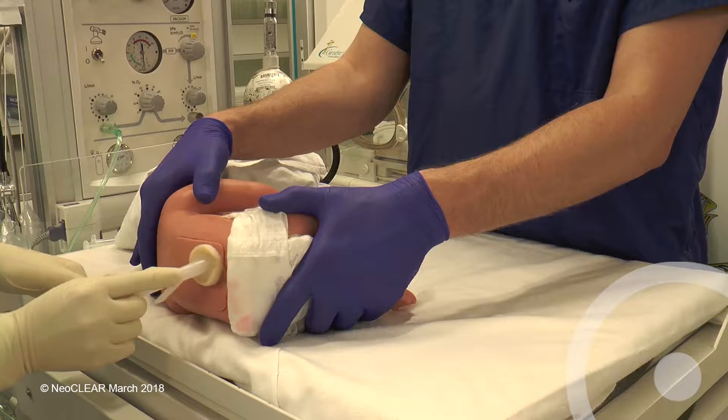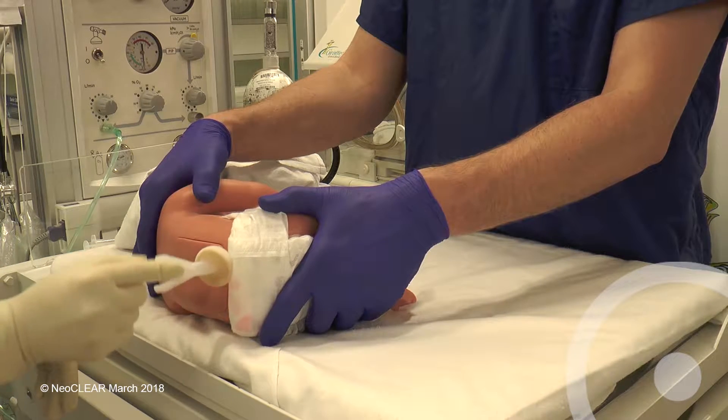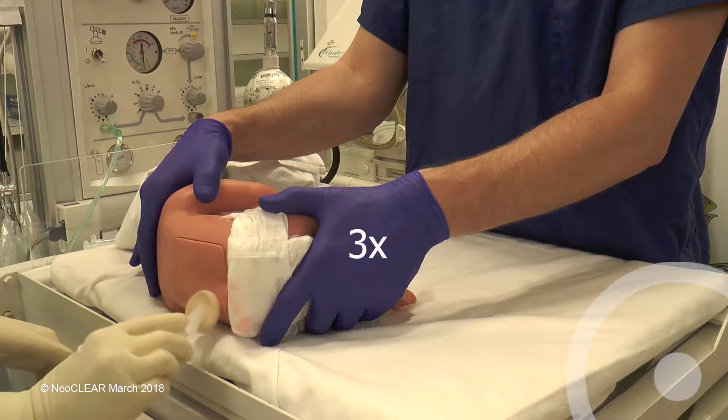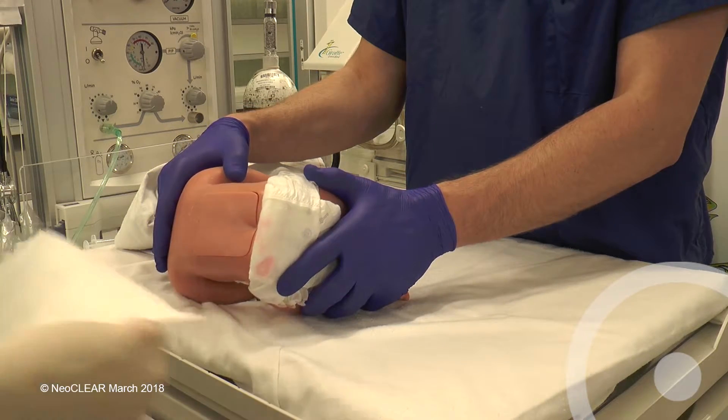Clean in a spiral from the lumbar region out to the iliac crests. This should be done three times and allowed to dry for 30 seconds. Place the baby on a sterile drape and remove the outer gloves.